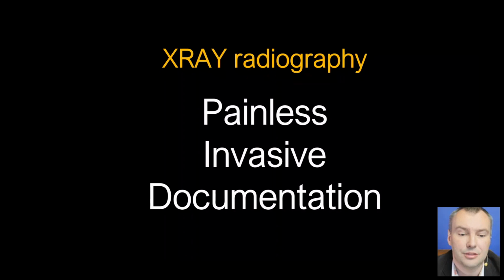X-ray radiography is something that we use when we look for class 2 cavities in the proximal or distal region, because otherwise it is not working well. For sure, it's painless, and we get the documentation, but we must remember that it is an invasive examination. We have radiation that our patient is exposed to, and it is not safe for the patient, especially if the X-rays are repeated. Nowadays, tomographies are repeated quite often with our patients, also due to some medical problems. So whereas the dose is small with one dental X-ray, a patient can experience a lot of radiation because of other medical problems.